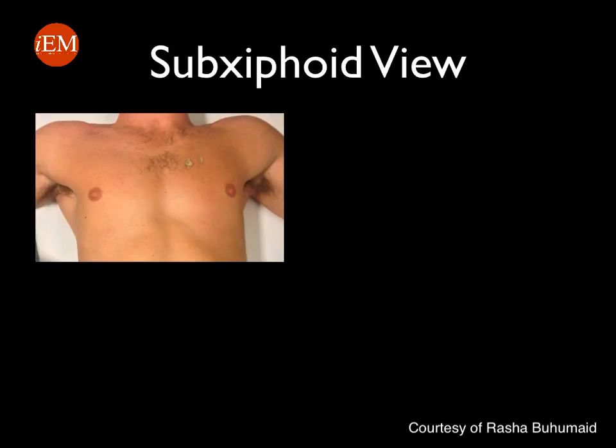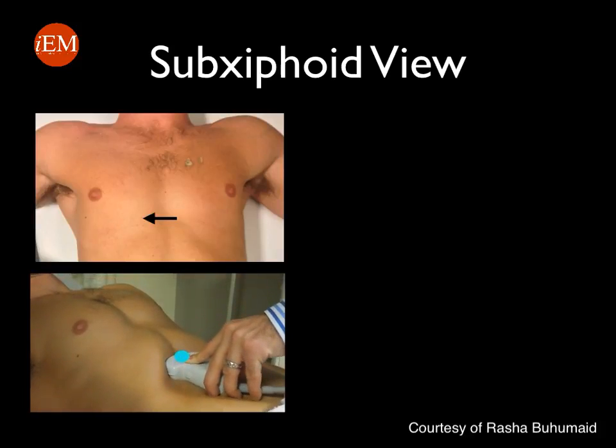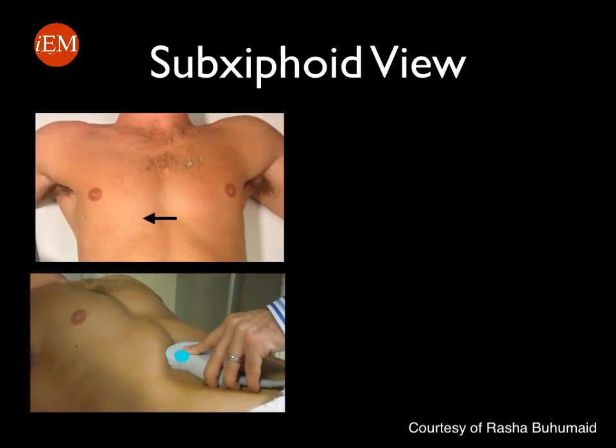First, the subxiphoid view. Your anatomical landmark for the subxiphoid view is the xiphoid process. You will place the probe just below the xiphoid process, and the probe marker will be pointing towards the patient's right. Note that the sonographer is placing the probe very flat, angling it towards the liver to obtain this view.